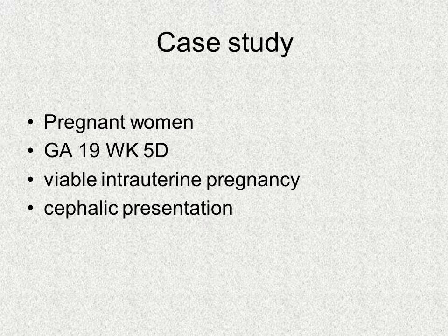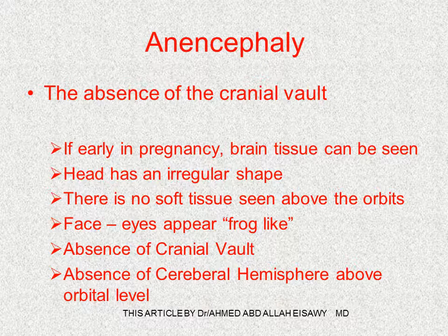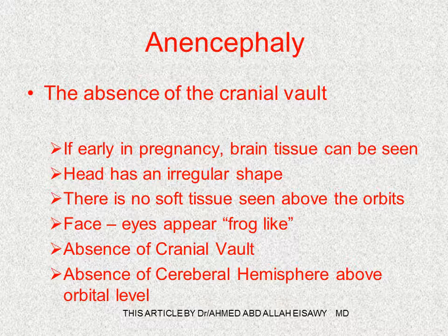Gestational age 19 weeks 5 days, viable intrauterine pregnancy. Anencephaly means absence of the cranial vault. Early in pregnancy, brain tissue can be seen. The head has an irregular shape; there is no soft tissue above the orbits. The face and eyes appear frog-like. There is absence of the cranial vault and absence of cerebral hemispheres above the orbital level.